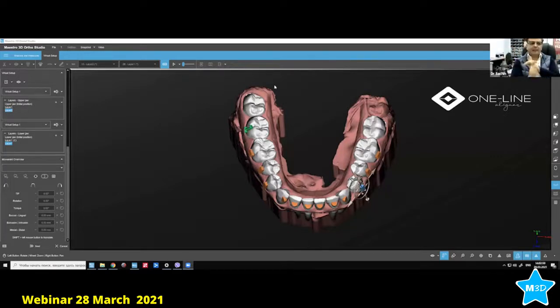So let's say you asked me about translation and rotation, right? That's a good question. So in my case, I use multiple layer sheets. Rotation is 2.5 to 3 degrees normally. In some cases, with smaller teeth, I'll go to 2 degrees, 1.8 to 2 degrees for smaller teeth.